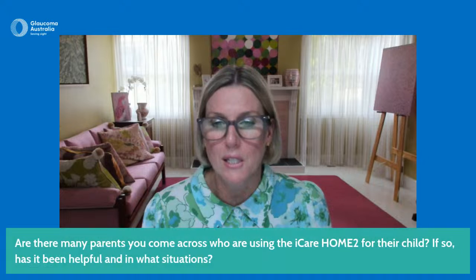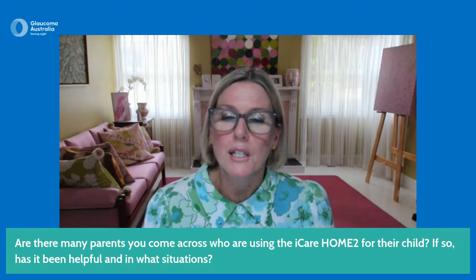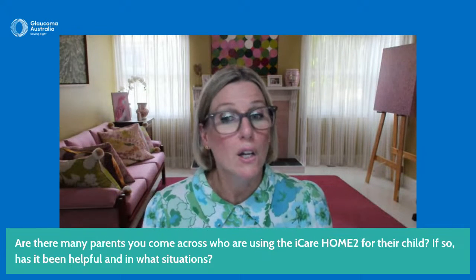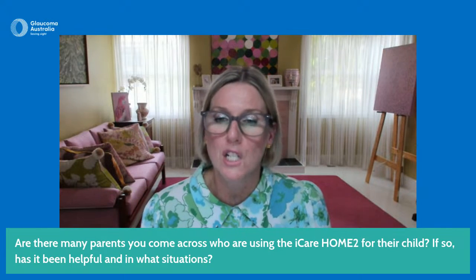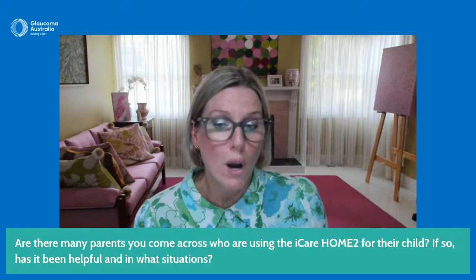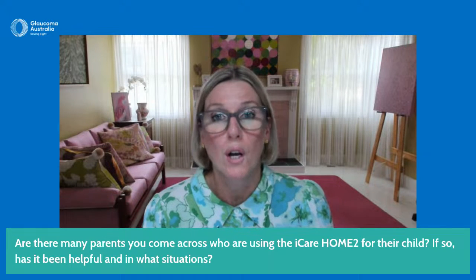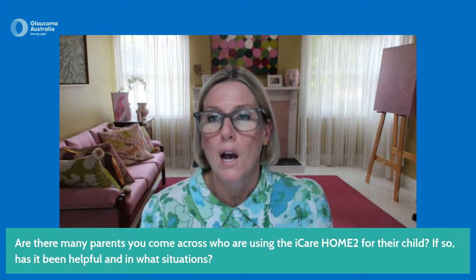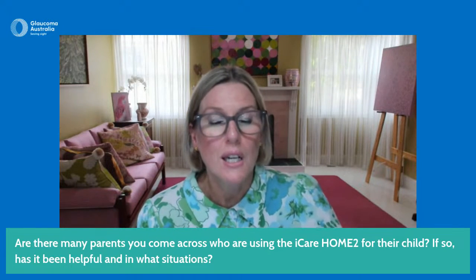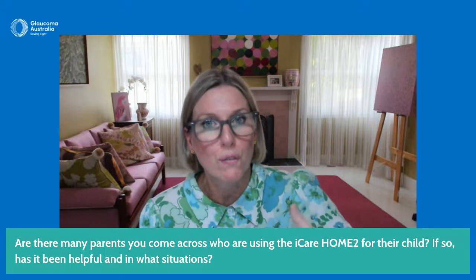And are there many parents you come across who are using the iCare HOME2 for their child? If so, has it been helpful, and in what situations? I personally haven't come across any that use the iCare HOME2, but I know that some of my colleagues have. I know that Dr. John Ruddle actually has. And that was for families that live quite remote and don't have access to a local optometrist, because sometimes you might be in a situation where you actually need to get your child's pressures measured quite often, and you're unable to come to the hospital for every one of those visits.